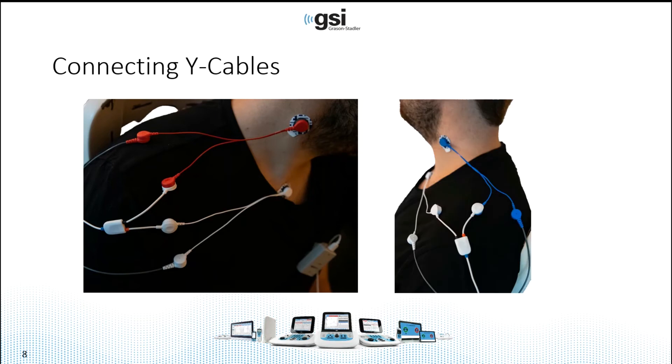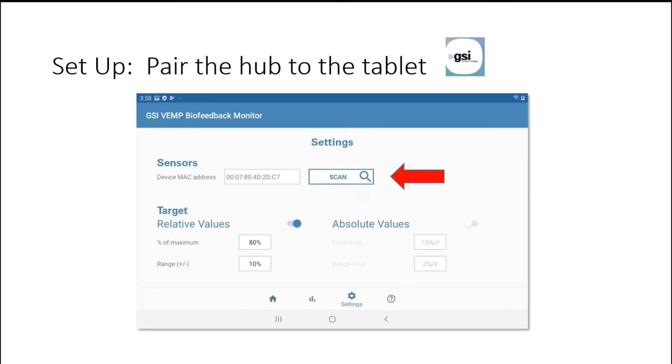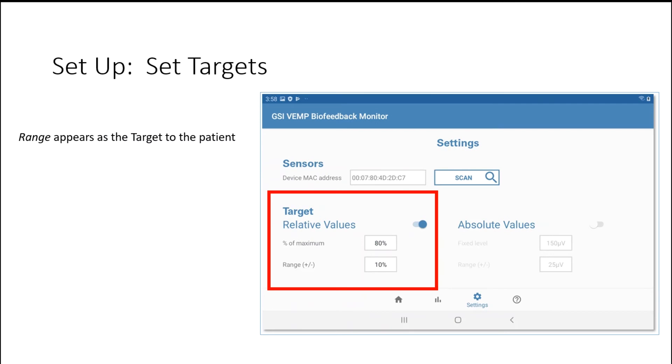Here's another view when testing the left side. When you turn on the tablet, tap the GSI icon to get to the home screen. The first time you use it, you'll have to pair the biofeedback hub to the tablet by going into the settings screen. In settings, press the scan button while the hub is on and the device MAC address will appear. Next, you set up the targets and the range that the patient is going to achieve during the biofeedback.